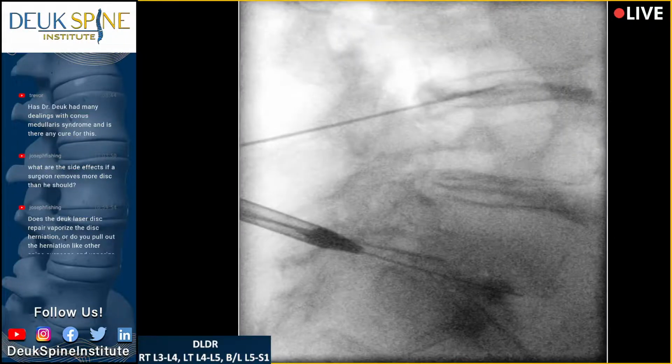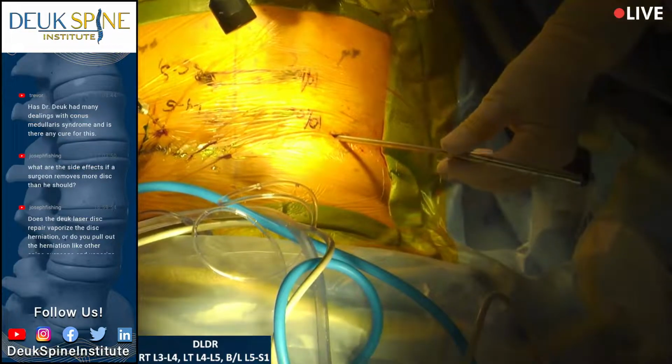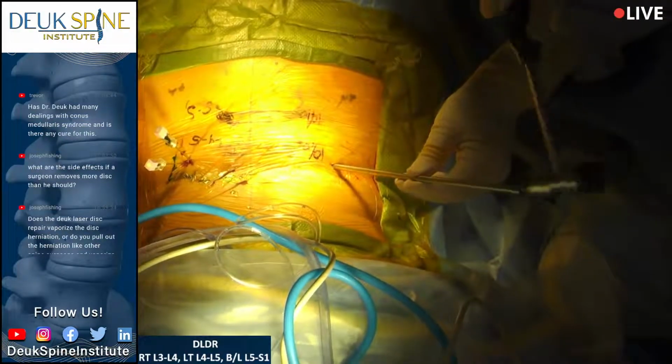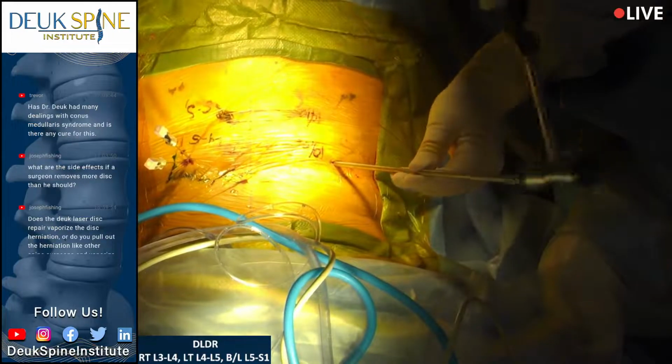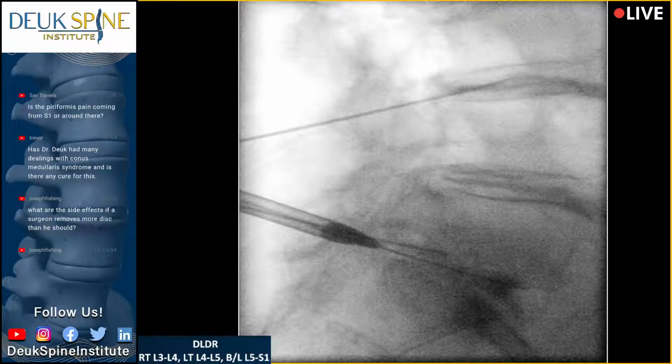Now remember, the window that I have to work in here is extremely narrow. This patient has tremendous arthritis, and arthritis means that the facet joints back there have gotten 2 or 3 times bigger than normal. There's a thickened capsule around the joint. There's all kinds of synovial hypertrophy and all kinds of grungy material. So it's basically impeding the movement of my dilator. But the dilator is following the guide wire, shot.